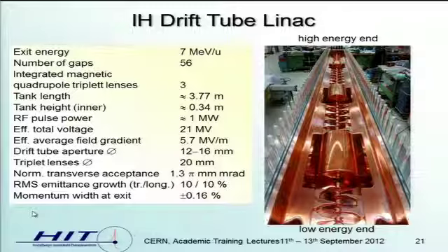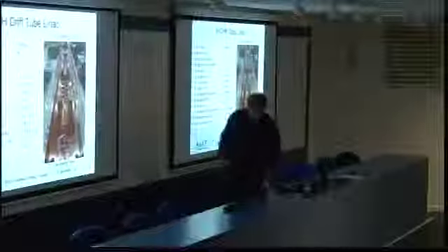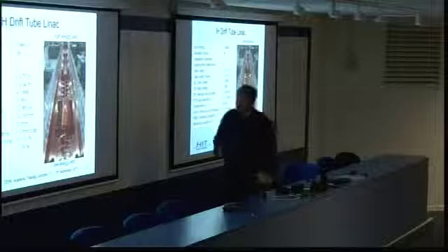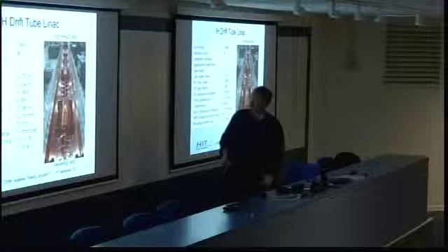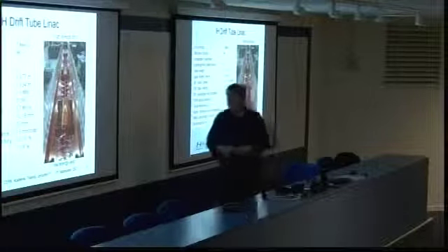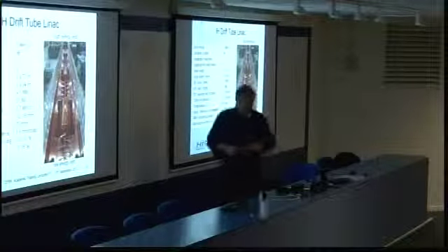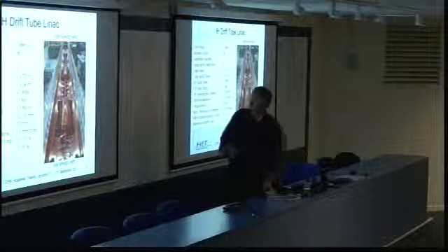So also these drift tubes, every one has another length, and all these have to be arranged in the right way and to be aligned. So this was also a long story for the prototype, not for the copies later on, which now work at GSI and in the Siemens facilities, and later on also in MedAustron.